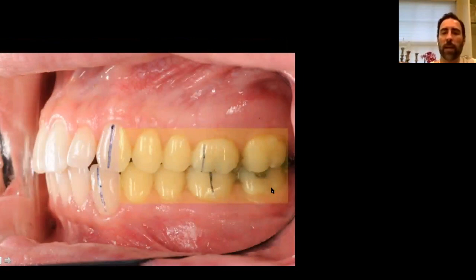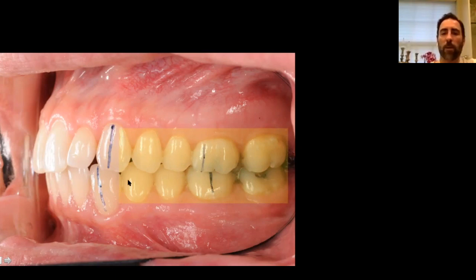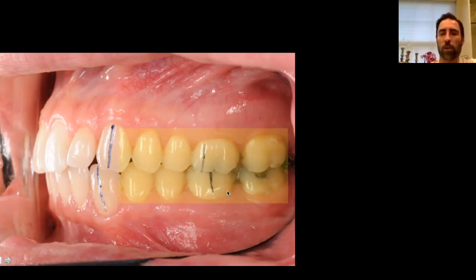When you want to diagnose or check if your picture is good, look at the section of the picture that's 90 degrees to you. This part is what we're staring at straight on — this is tailing away from us. When you have a good lateral arch shot, this is what you're looking for: you want to look straight on at the first molar and the bicuspids. I haven't gotten to how you get there — we'll talk about that.